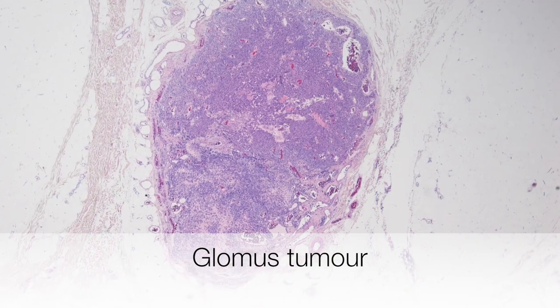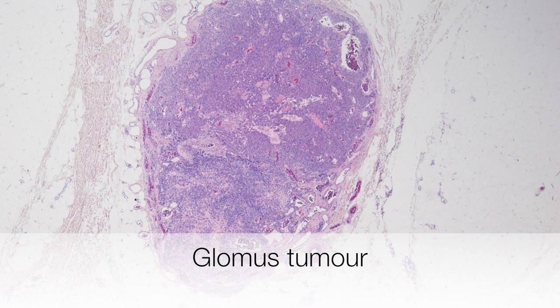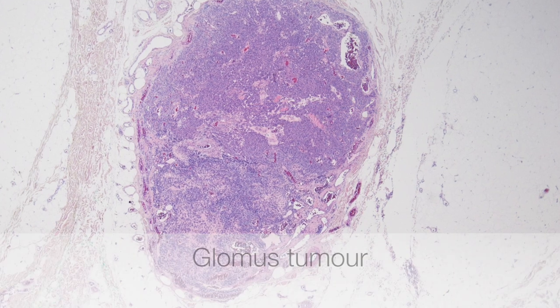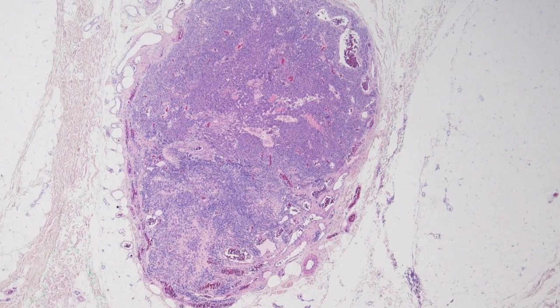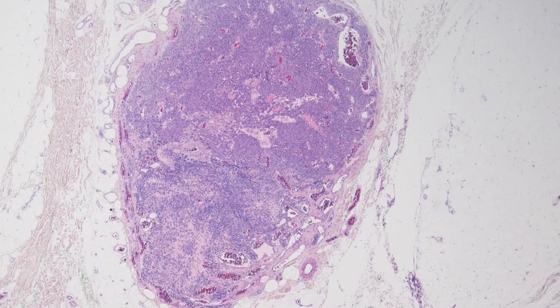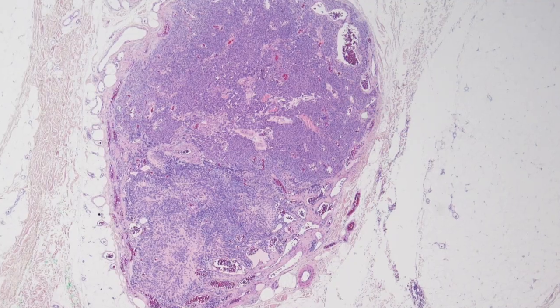This is a typical low-power appearance of a glomus tumour. It is well circumscribed and here it is situated in the subcutaneous tissue.